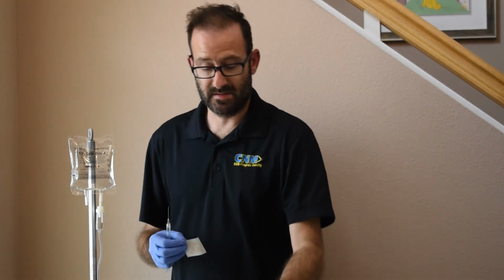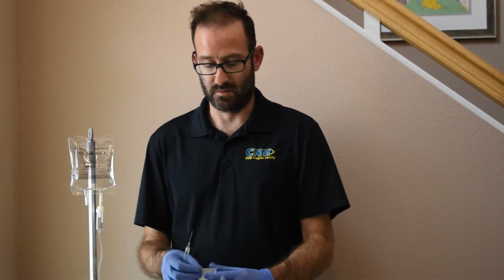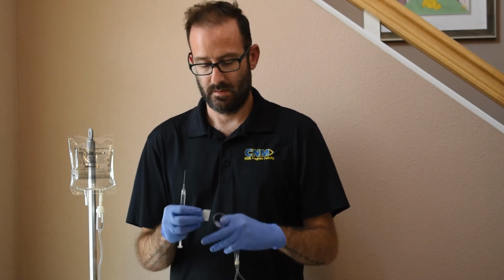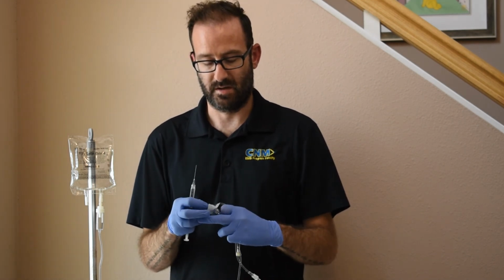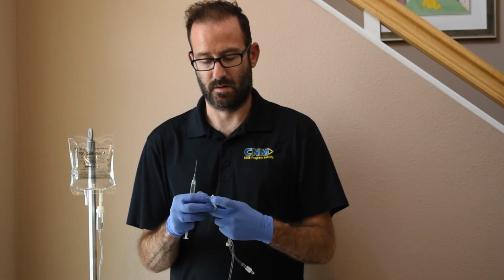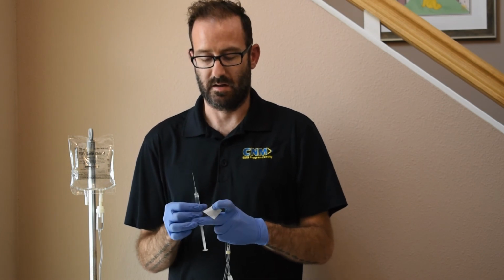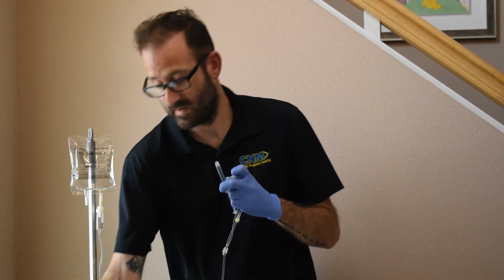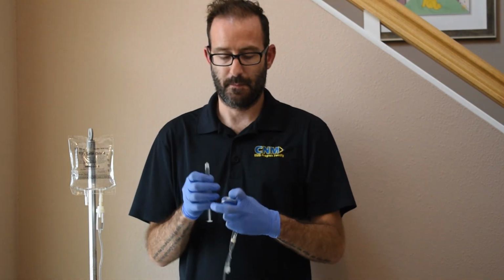If we're going to be giving the same medication through the needleless port, I'm still going to take my alcohol swab, clean the location, and I'm actually going to hold this alcohol swab on here while I remove my needle, and I'm going to dispose of that in my sharps container.